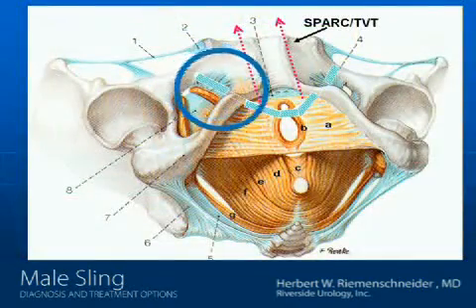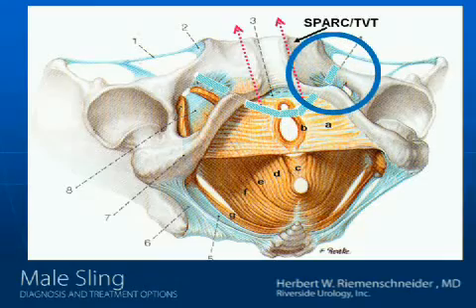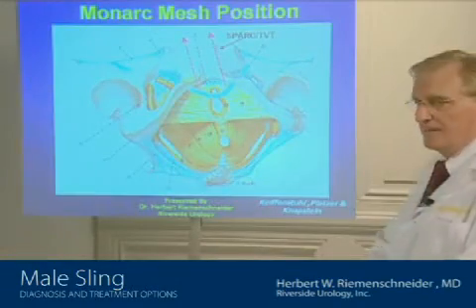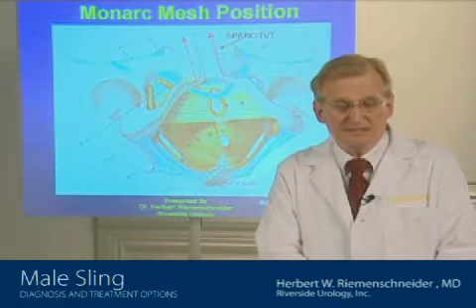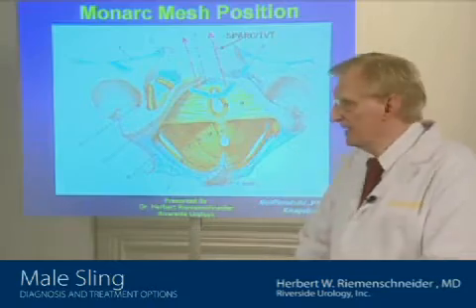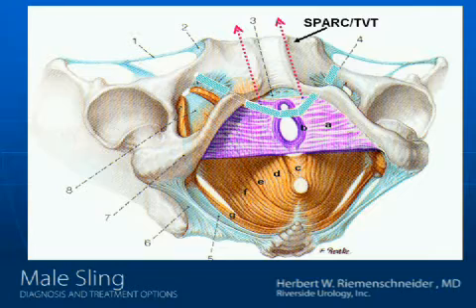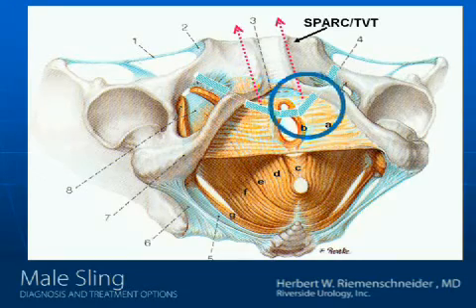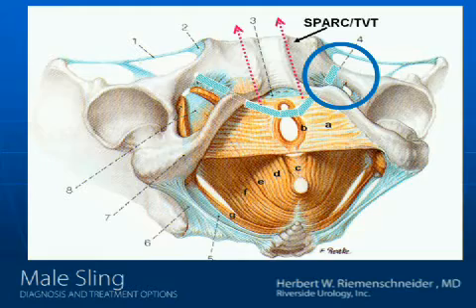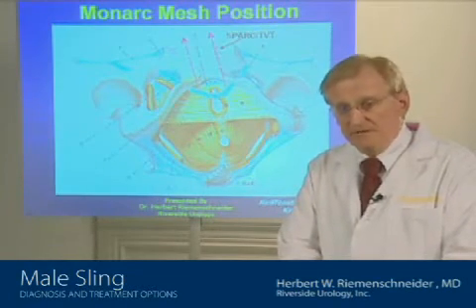This is actually a female pelvis, and this shows a sling that now has been used for well over a decade and has made many women much more comfortable with their lives by simply giving them the ability to be dry. How does it work? Well, these are muscles of the pelvic floor, and this sling, which comes around the tube through which the urine passes, called the urethra, enhances the support of the shutoff mechanism or the sphincter and can do great things for them.